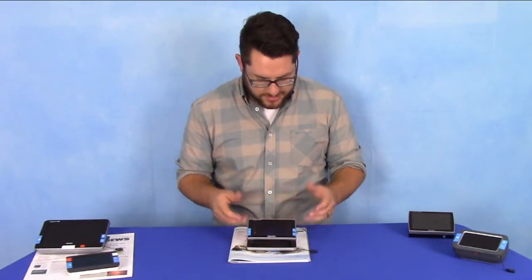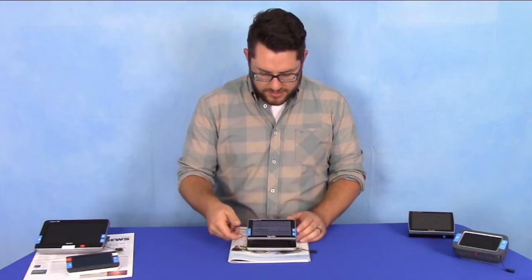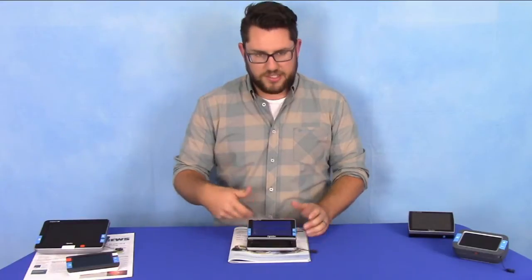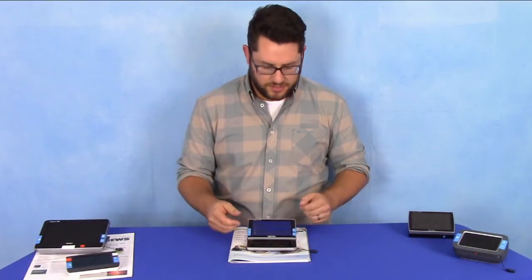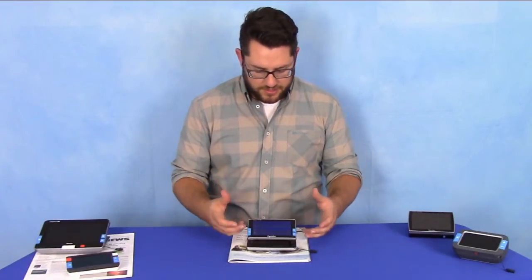I can set my magnification and my reading mode. On this side are our buttons — the mode button can change through the color contrast and false colors. On the other side I have my zoom in and zoom out buttons. Very easy, very simple to use.